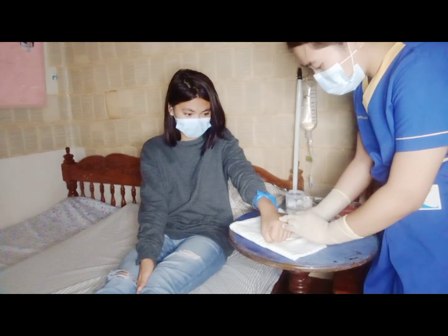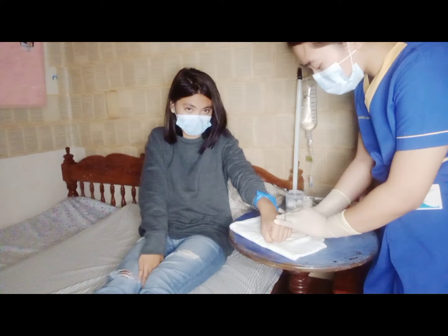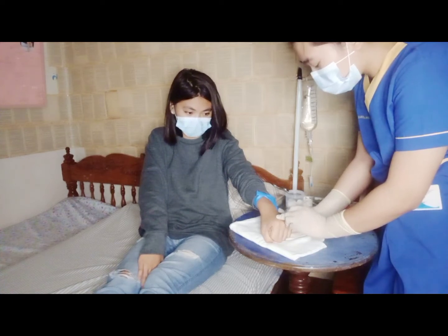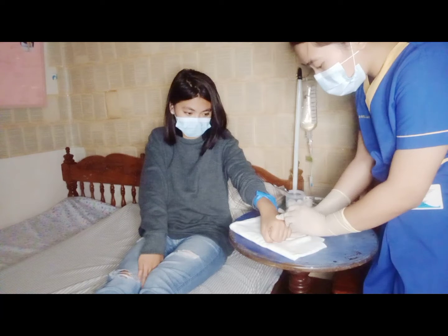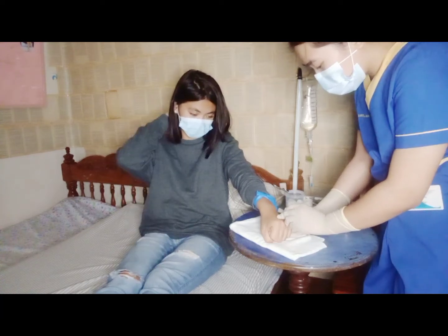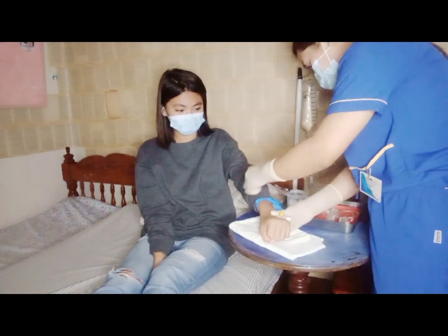Okay? So, we will advance the device until the hub of the device is at the venipuncture site. Okay? Then, we'll remove the tourniquet.